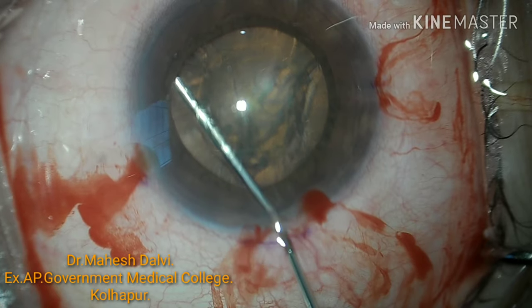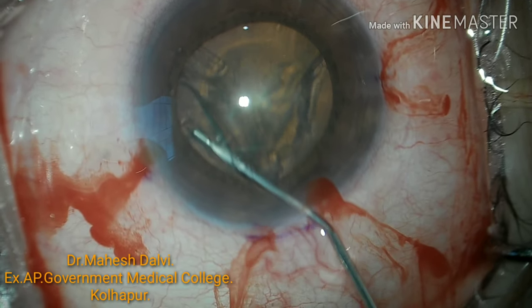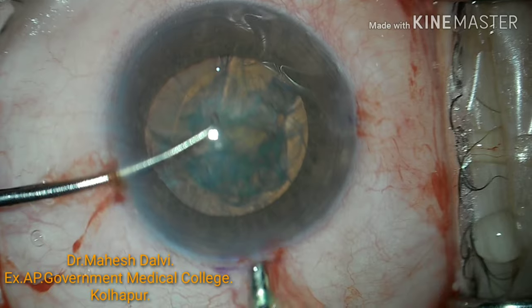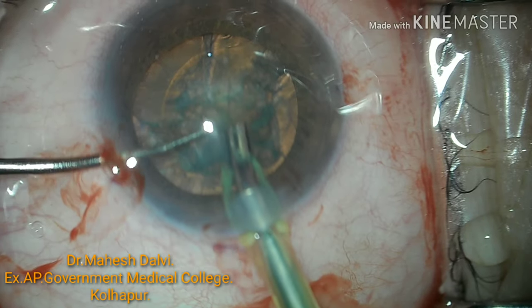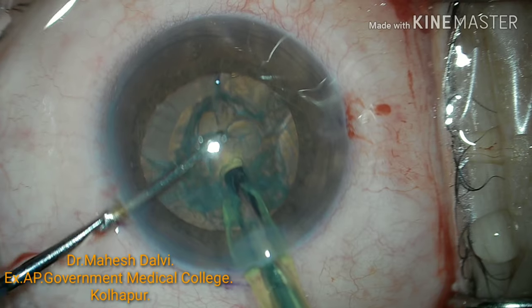The main advantage of this incision marker is we can just apply it in any case and maintain the uniformity of all the incisions as well as side ports. So every time we don't have to worry regarding the site of the incision.